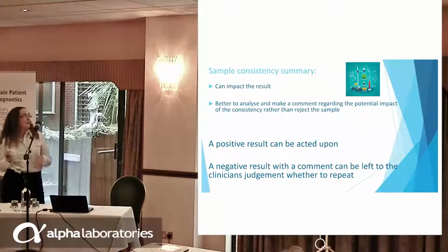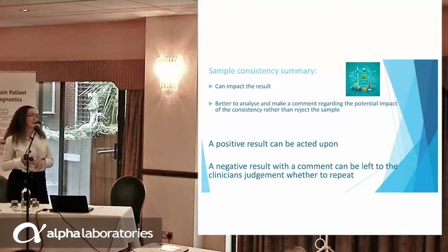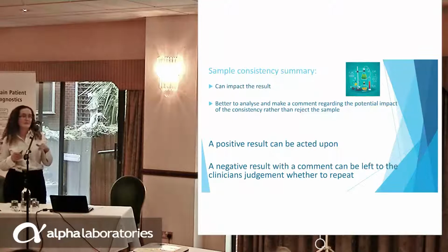So in summary, on the stool consistency, it can impact your result. So you need to understand how you're dealing with these different samples. And personally, I do think it's better to analyse the samples and to make a comment regarding the consistency and what potential impact it's had, rather than to reject the sample.